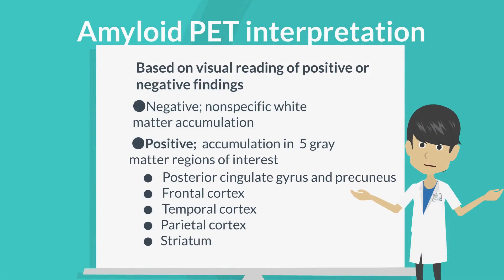Amyloid PET interpretation is based on visual reading of positive or negative findings. Nonspecific white matter accumulation is regarded as a negative finding. Gray matter accumulation in five regions of interest — posterior cingulate gyrus and precuneus, frontal cortex, temporal cortex, parietal cortex, and striatum — is regarded as a positive finding.